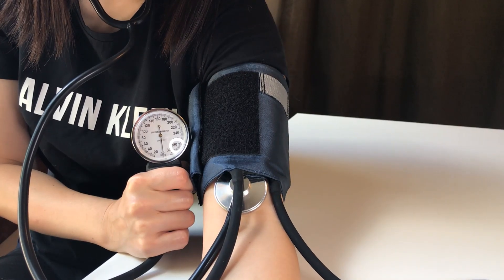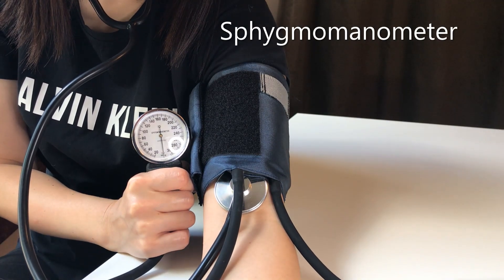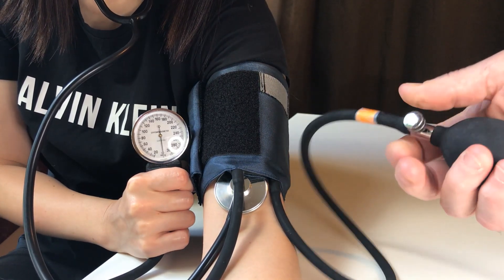I've attached a sphygmomanometer — you may call it a blood pressure cuff — to the arm of my lovely wife and assistant here, and I'm going to demonstrate how to take a blood pressure and explain what's going on. There's a little bulb with a screw valve on it.